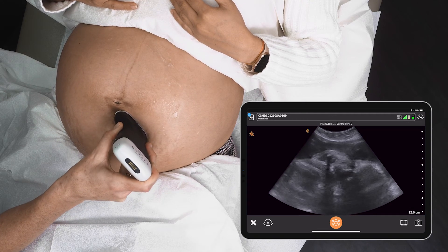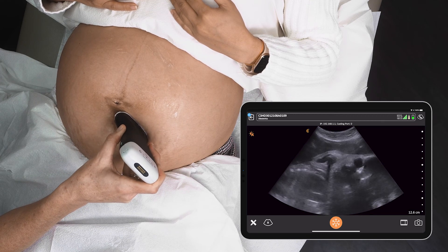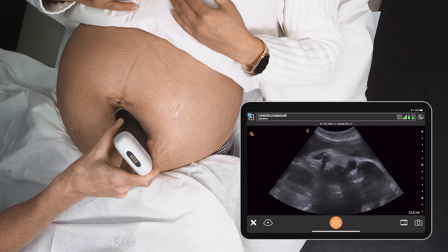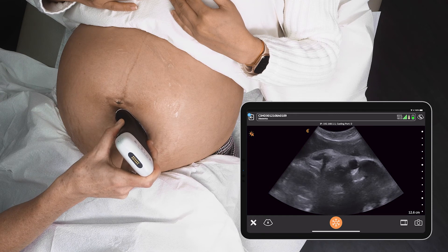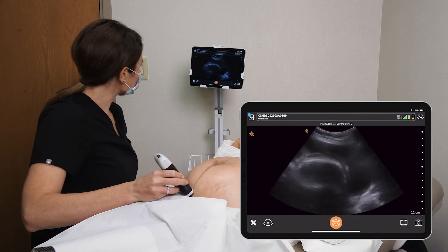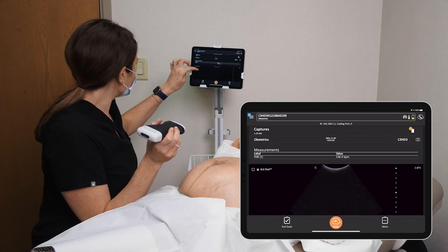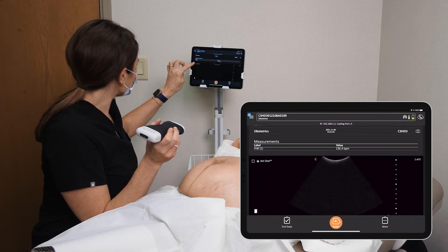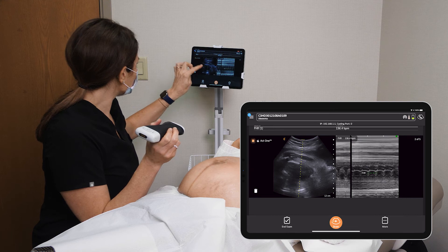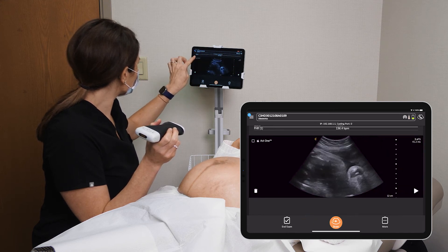Let's try to get a nice picture for you. There we go. Now I can actually go back and select which photos and videos to send to our patient.